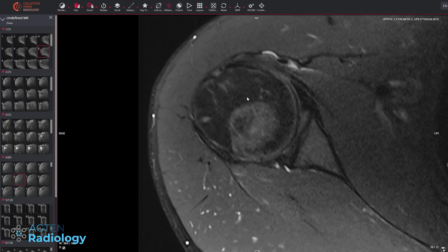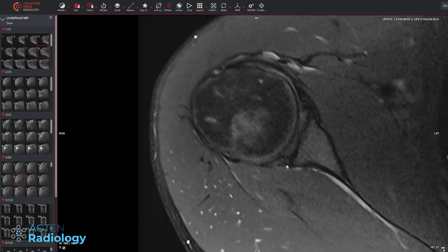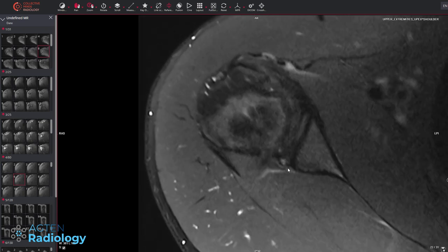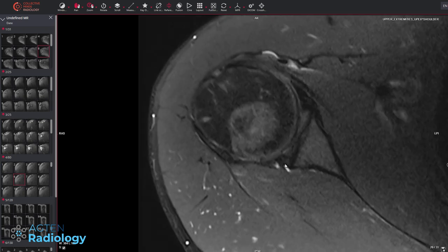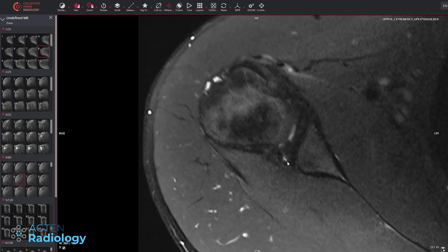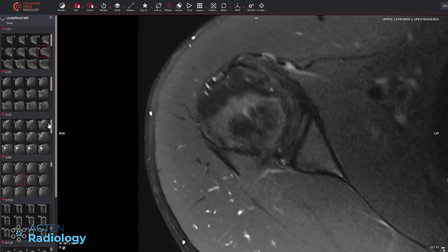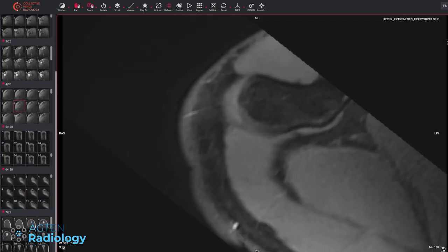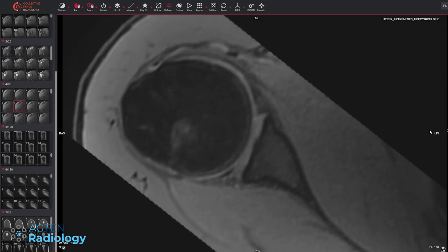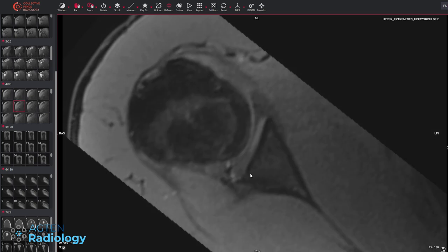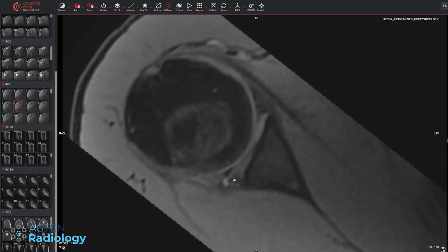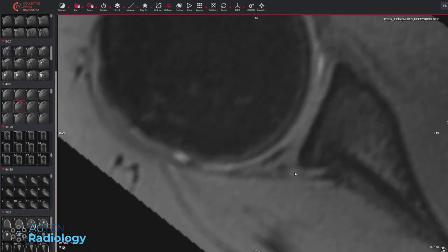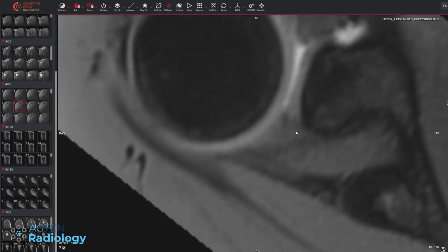Looking at the joint, the humeral head is not significantly posteriorly decentered, but the posterior labrum is abnormal. We have high signal and maybe tiny ganglion cysts coming out at the posterior-inferior region — we've got a labral tear. On the 3D sequence you can nicely see the long head of the biceps tendon going down, and the abnormalities in the labrum — a clear labral tear with a tiny ganglion cyst, a second cyst, and some other small cysts. So we have an extensive posterior labral tear.